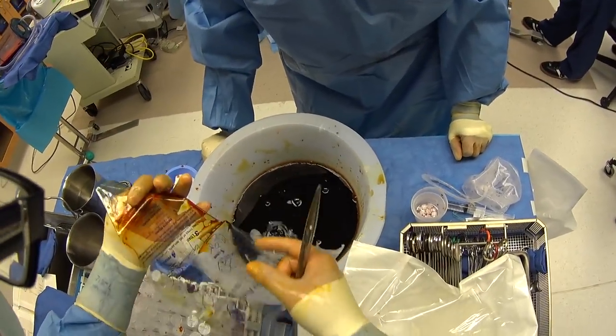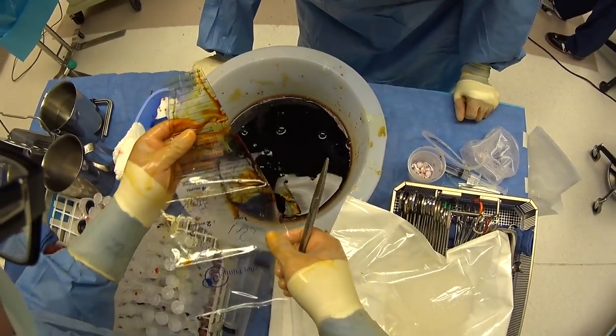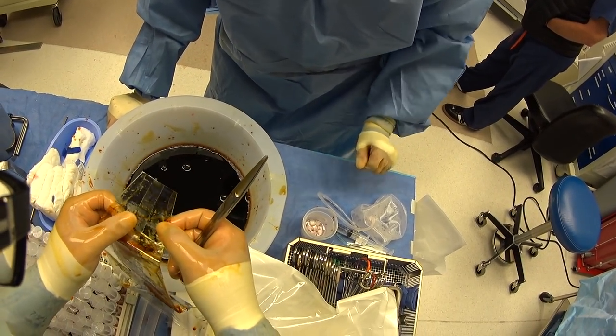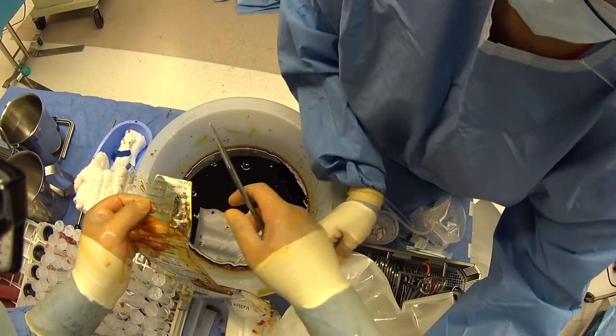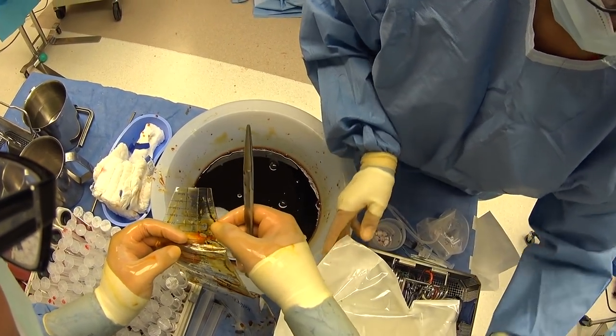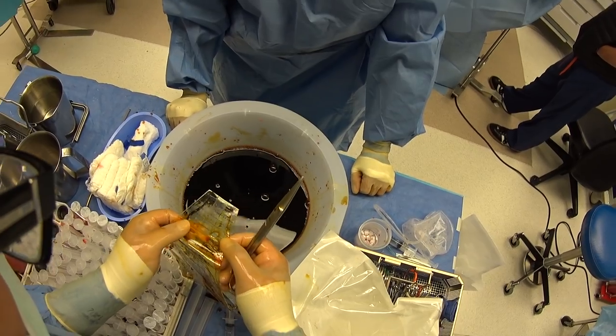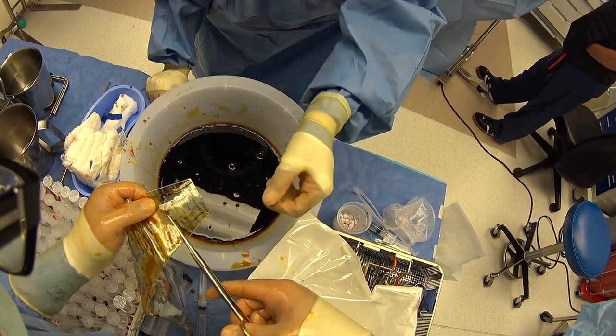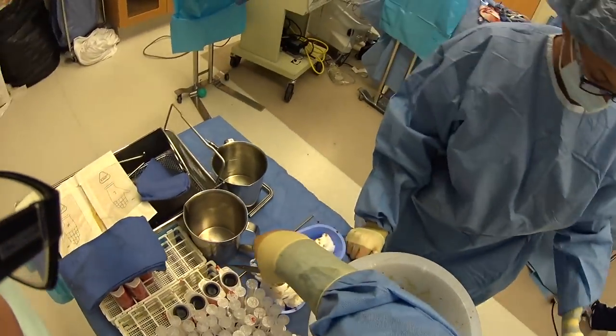Here we have our Keller funnel, which is most often used for breast implants and breast augmentation, but I use it for our butt implants as well for a couple of reasons. One, it lets us minimize the scar and incision size. Two, it keeps the butt implant from touching any of the skin around the buttock. And three, it makes it a little bit easier for me to put the butt implant in.